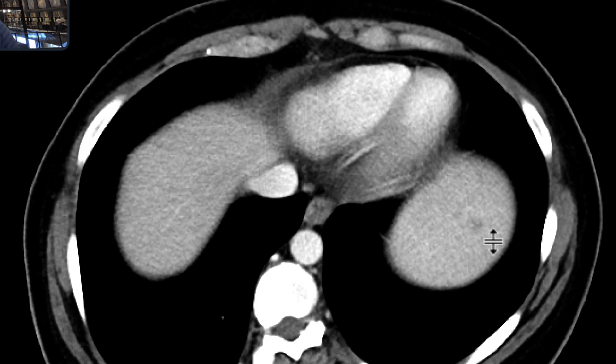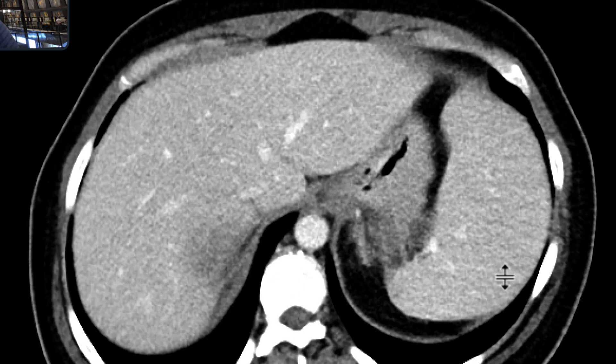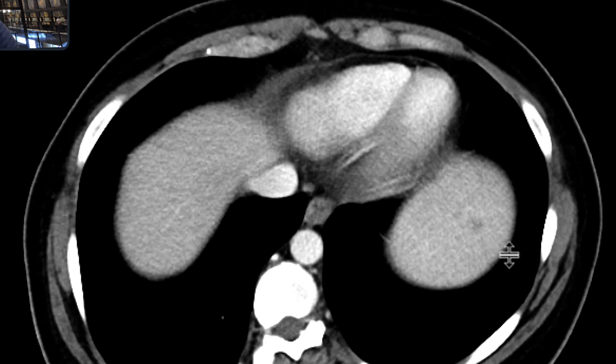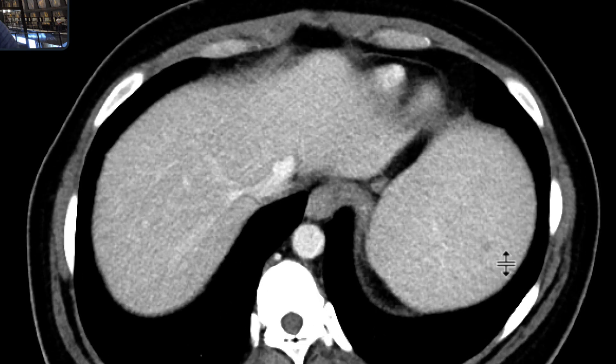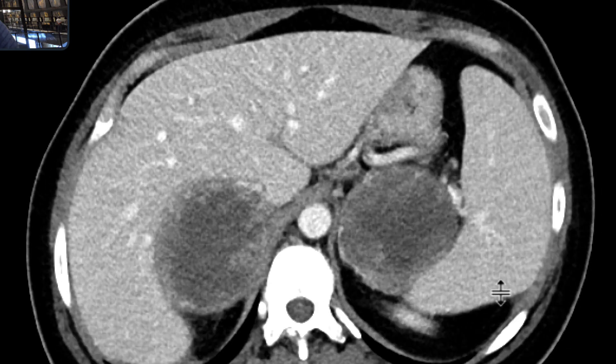We can start to see that there are multiple hypodensities in the spleen. In the setting of melanoma, those would be concerning for metastases.